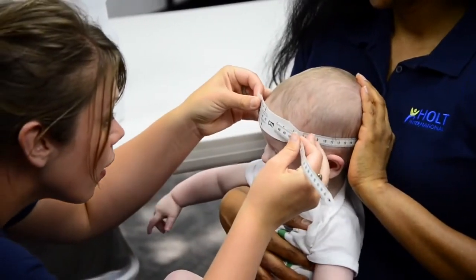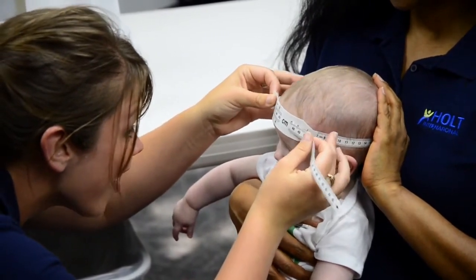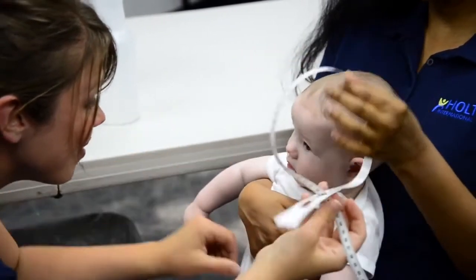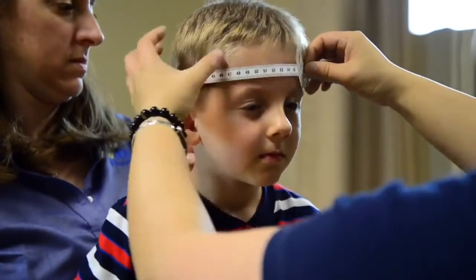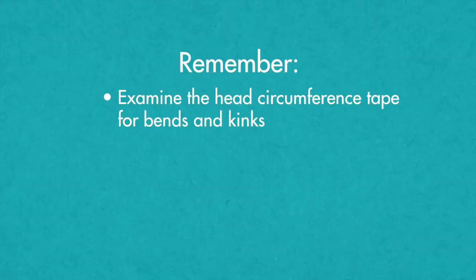Read the measurement between the arrows in the window of the head circumference tape and call the number out loud. The measurement should be taken to the nearest millimeter and recorded to the first decimal. Always look for bends or kinks in the head circumference tape before every use.